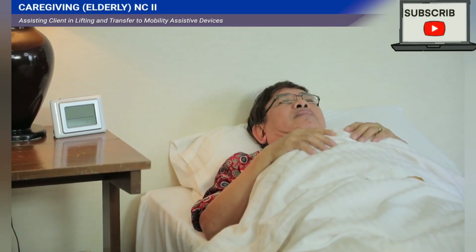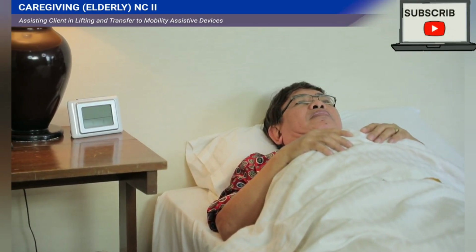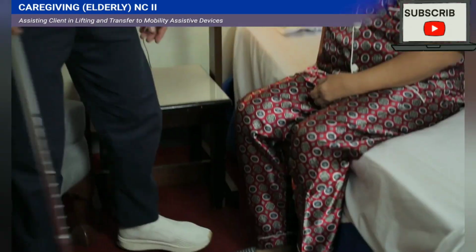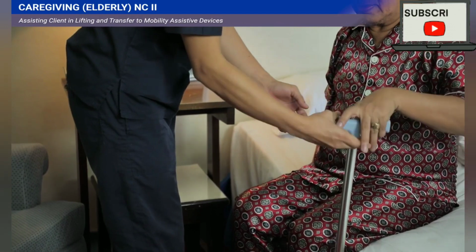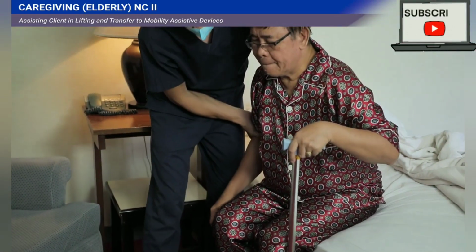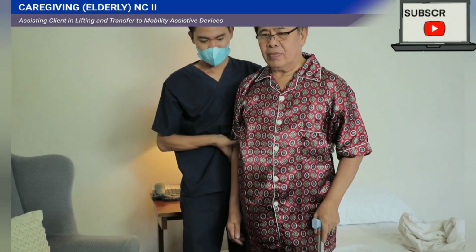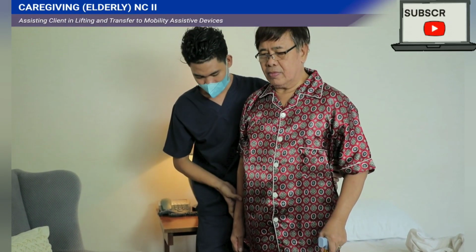If the client will use a cane as his or her assistive device, here's what you should do as a caregiver. Give the cane to the client. Make sure that the cane is of proper height to the client. The proper height of the cane should measure from the floor to the crest of the client's wrist.